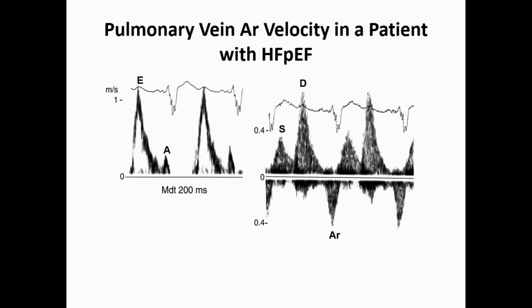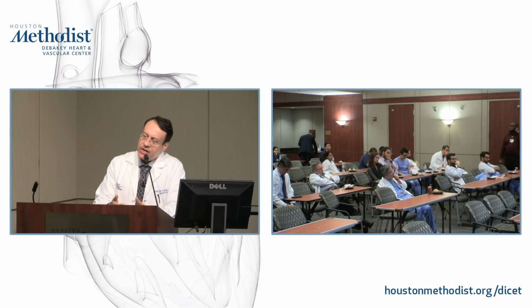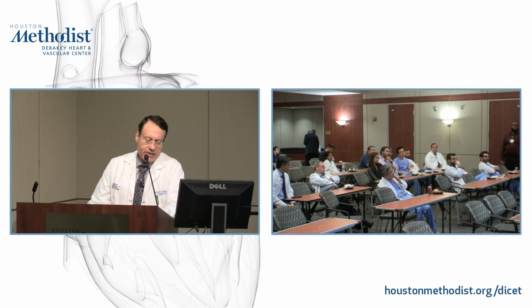Similar to the ventricle, if you increase the afterload of the ventricle, for the first few beats before homeometric autoregulation takes place, LV contractility drops. So EDP is up, the afterload for the atrium is up, mitral A drops. It's a harder thing for the LA to send blood across the mitral valve.